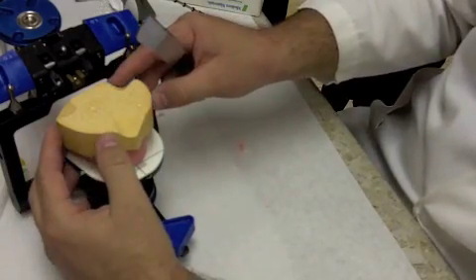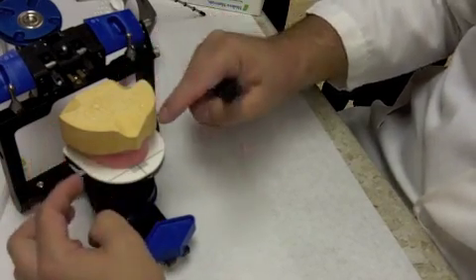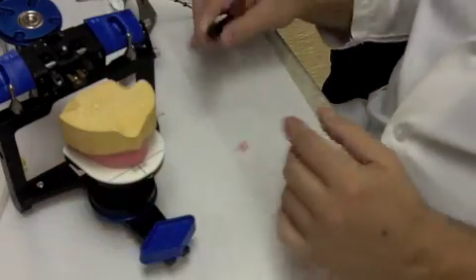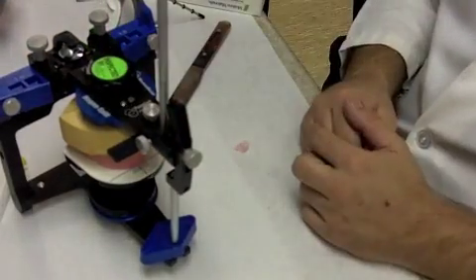And then you want to look laterally here, and you want to position the cast so that it's centered relatively evenly, so you have an even amount of space on both sides. So once you have that even space on both sides, you have the facial up to that line, that anterior line, and then your midline is lined up with the central line.